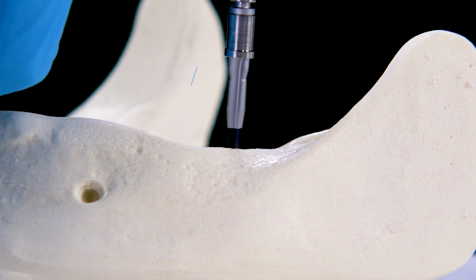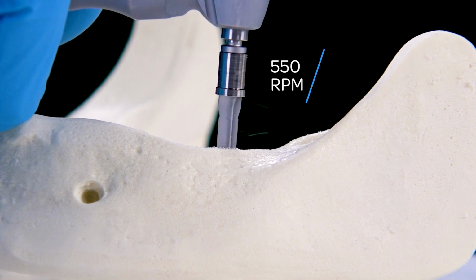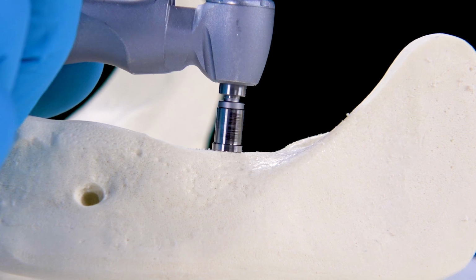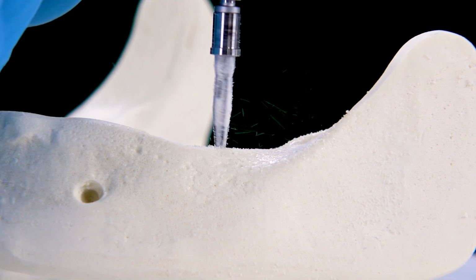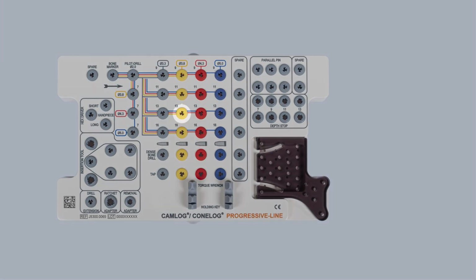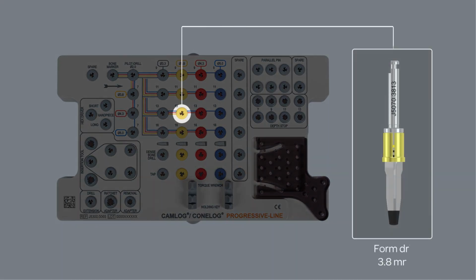Form drilling 3.3 mm. The small graduations in diameter achieve a gentle preparation of the bone. Form drilling 3.8 mm.